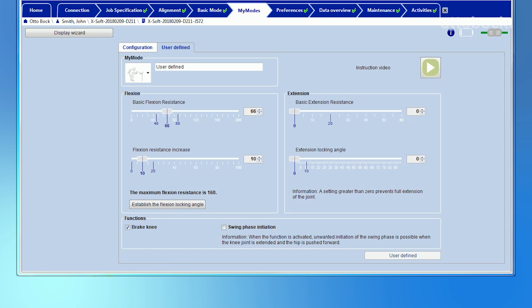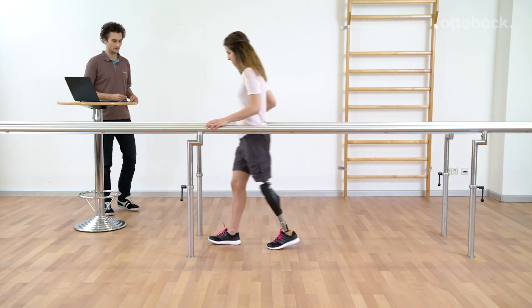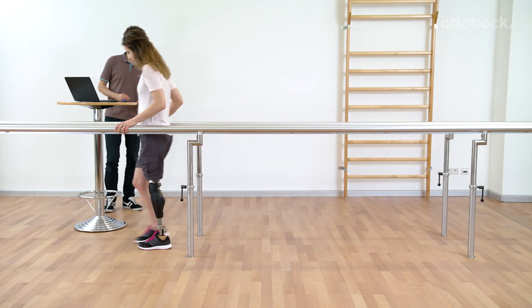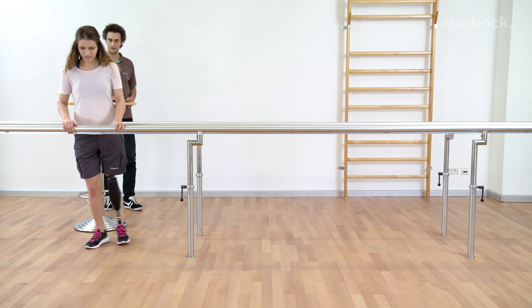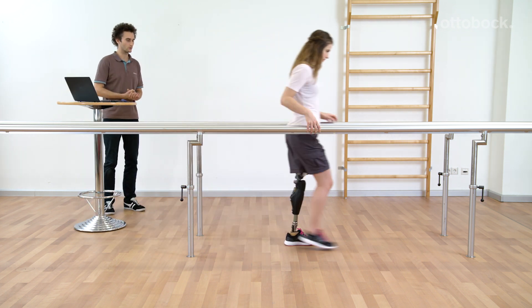The swing phase can be activated, but the option to activate the swing phase is only available when using a Genium X3. If available, it can be activated for every My Mode. The settings for flexion and extension have no influence on the swing phase behavior.